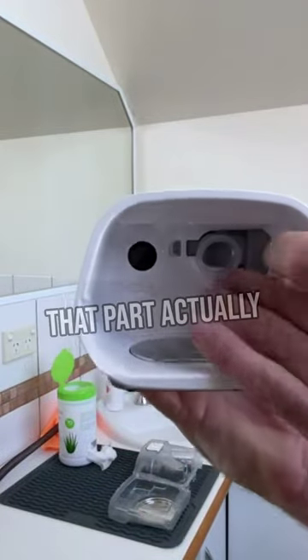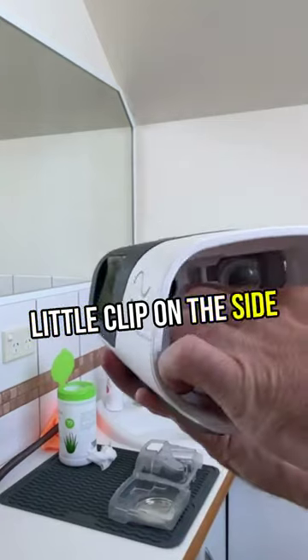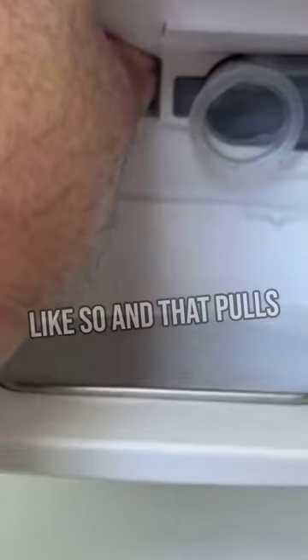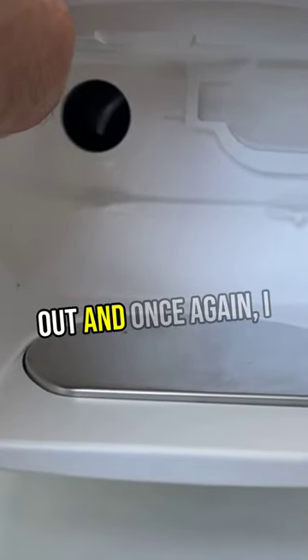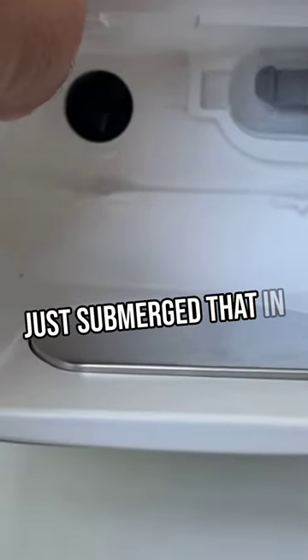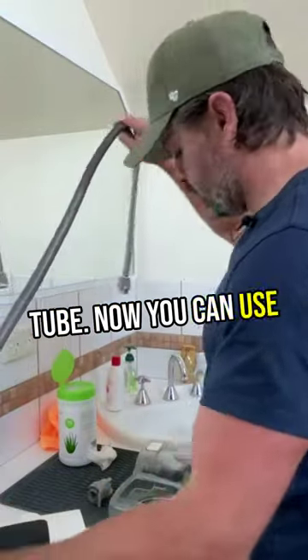You can see that part actually comes out — there's a little clip on the side. Press that clip and it pulls out. Once again, just submerge that in the warm soapy water and you're done. Now we've just got the CPAP tube.